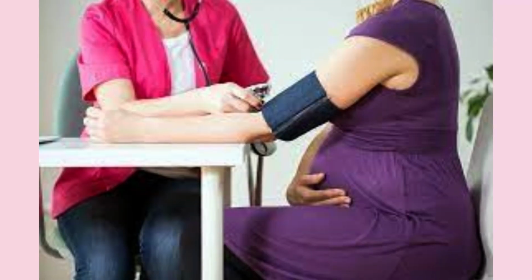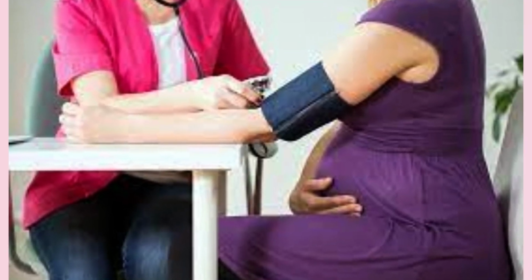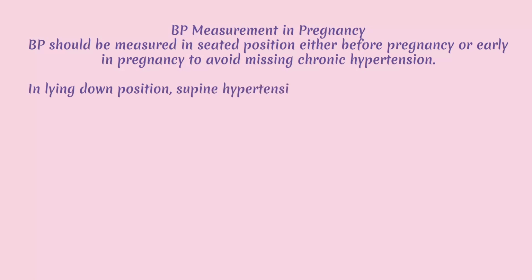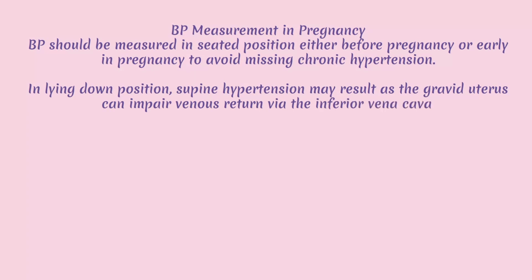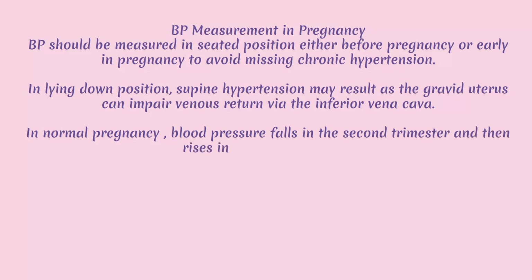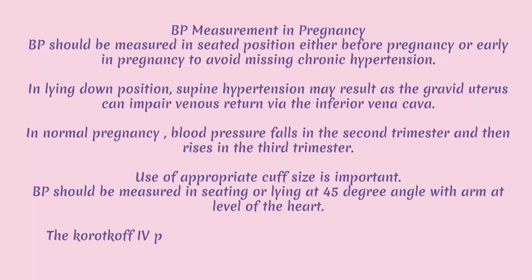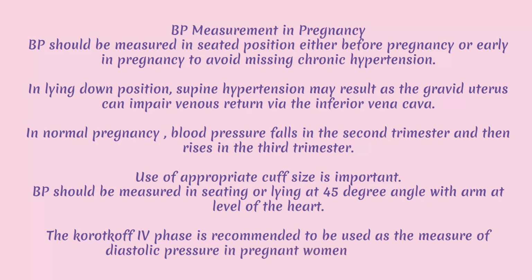BP measurement in pregnancy. BP should be measured in seated position either before pregnancy or early in pregnancy to avoid missing chronic hypertension. In lying down position, supine hypertension may result, as the gravid uterus can impair venous return via the inferior vena cava. In normal pregnancy, blood pressure falls in the second trimester and then rises in the third trimester. Use of appropriate cuff size is important. BP should be measured seated or lying at 45-degree angle with arm at level of the heart. The Korotkoff phase 4 is recommended to be used as the measure of diastolic pressure in pregnant women by the WHO.